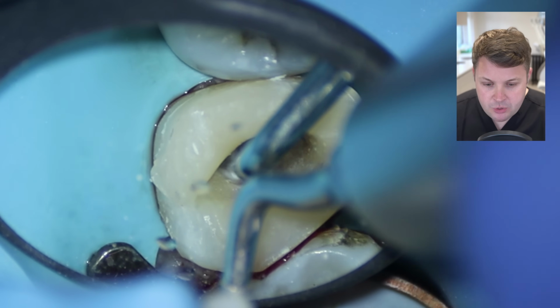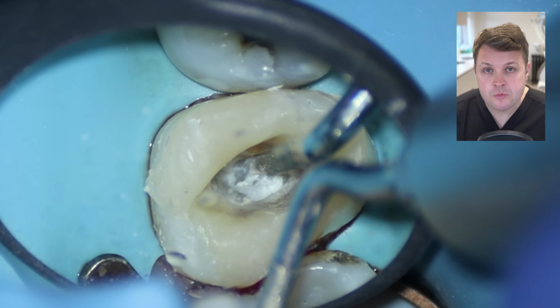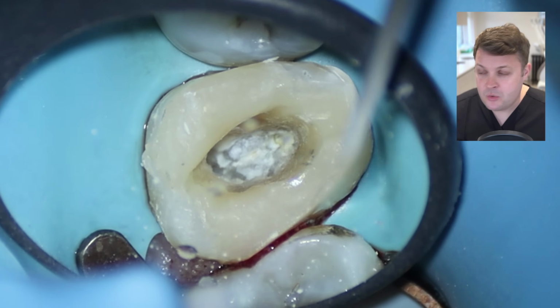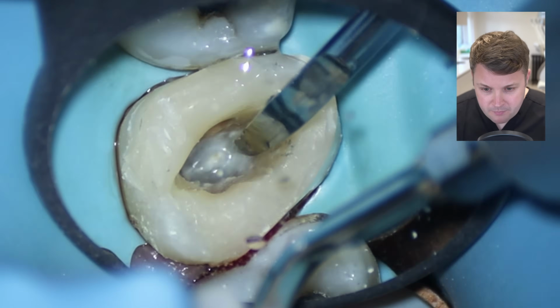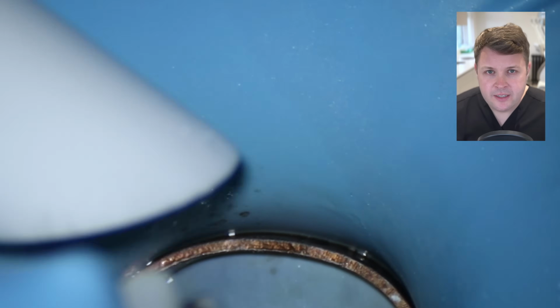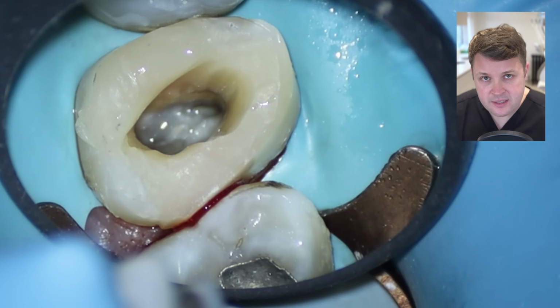But what I'm going to use is a low energy ultrasonic just to remove some of the pulp chamber floor. Got to be careful you don't perforate the tooth, of course. Once we've used the low energy ultrasonic, I'm using the high energy just to give a bit of a clean out and have a look around. I'm also looking for the MB2 in this case. I'm looking at this tooth and thinking about where the DB might be, and where the palatal is and where the MB is.